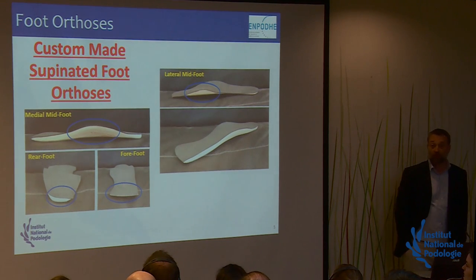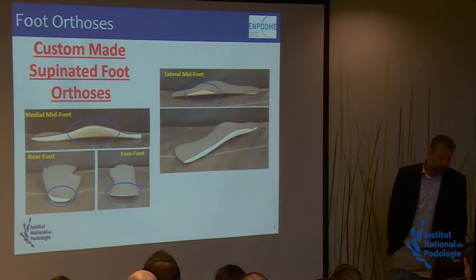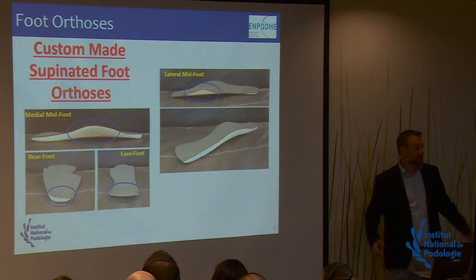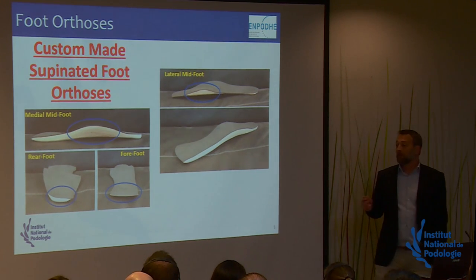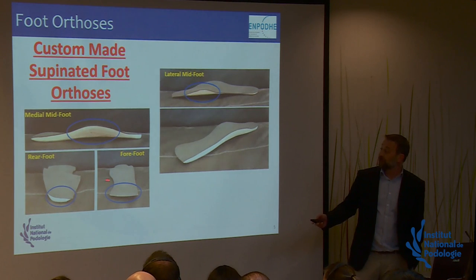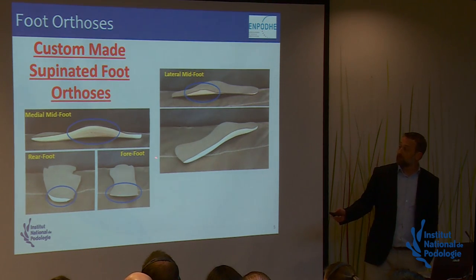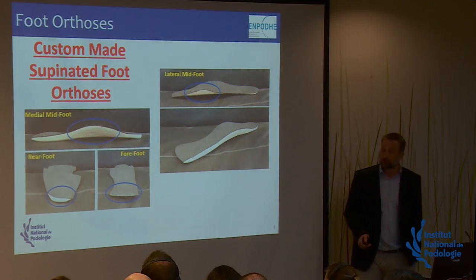So how are the Alain Lavigne biomechanical foot orthoses made? In this study, I used a 70 degrees Shore A hardness to fully correct the foot. Maybe begin with the forefoot. That's what we customize first, to give a slope to the forefoot, and then the whole orthosis will result from this slope. It means we will have a medial midfoot and a rear foot correction, and of course a lateral midfoot correction too.